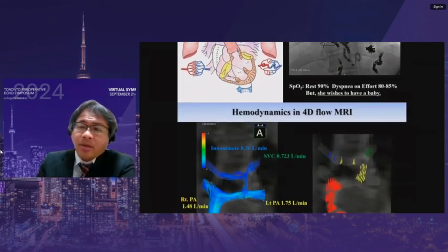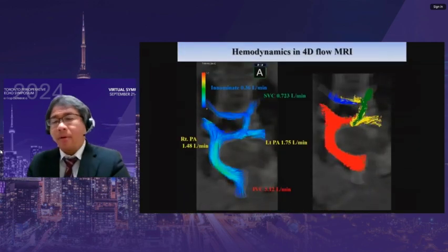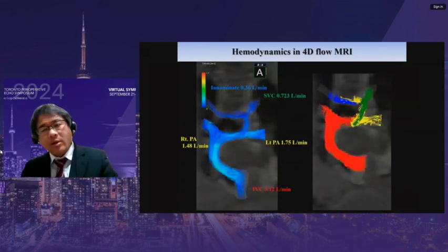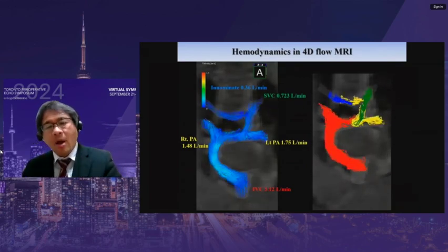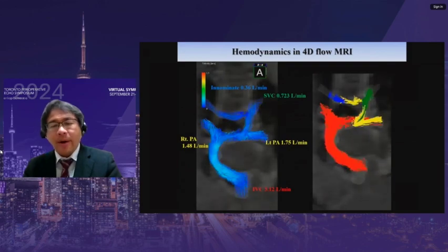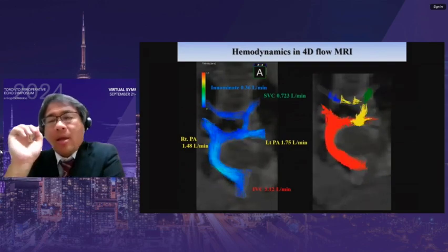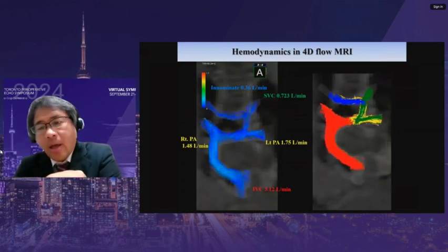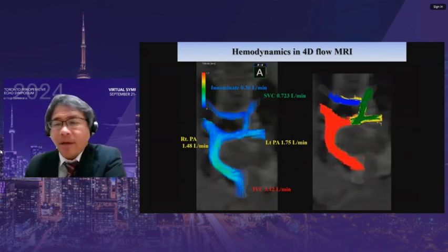An examination by 4D flow MRI demonstrated the maldistribution of IVC flow — illustrated in red color — going predominantly to the right pulmonary artery, due to flow collision from the left-side branch.